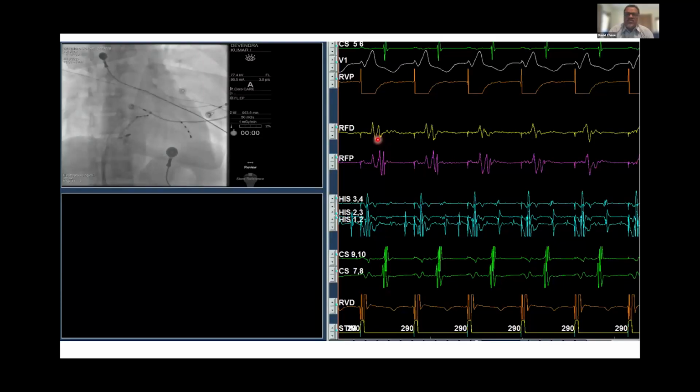And after the pathway is ablated, the potential is no longer seen. So being able to see a potential either between the V and A EGMs on the ablation catheter, or in the other scenario where you are atrial pacing and seeing the ventricular event happen later, you may see it between the A and the V. So here this is pacing the V, you may see it between the V and the A. That would be evidence of a pathway conduction depolarization resulting in a potential.